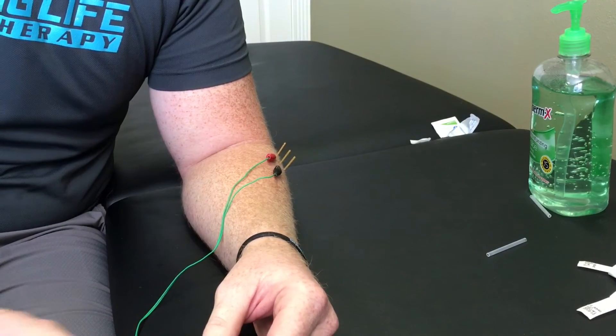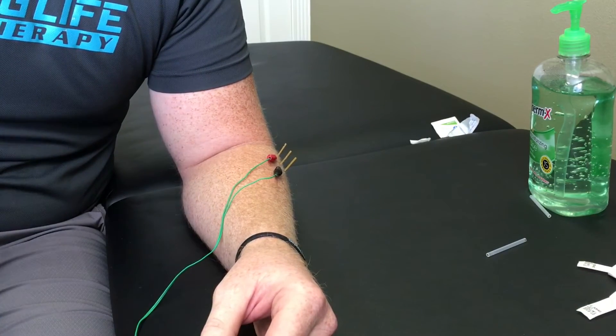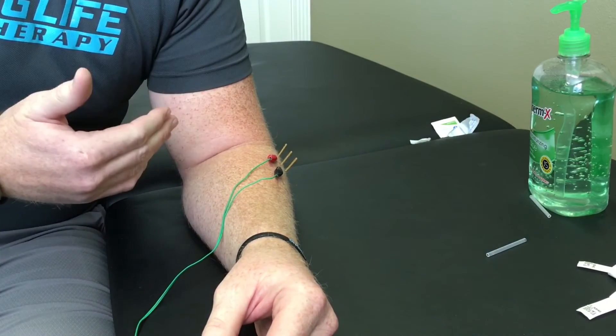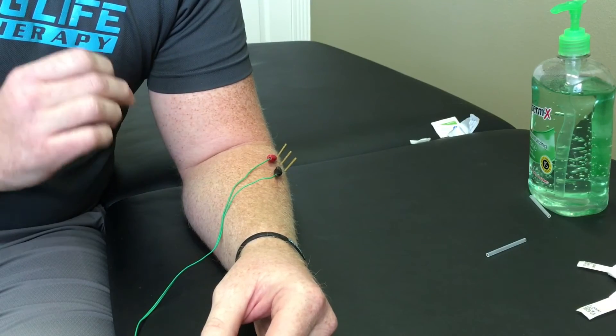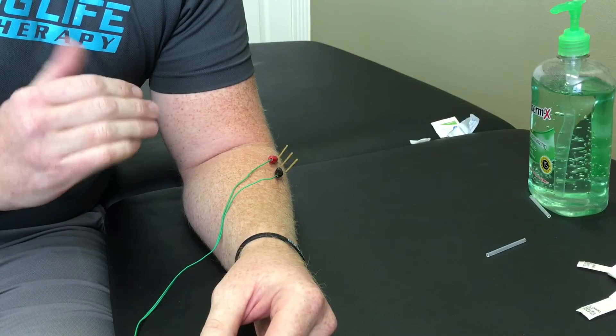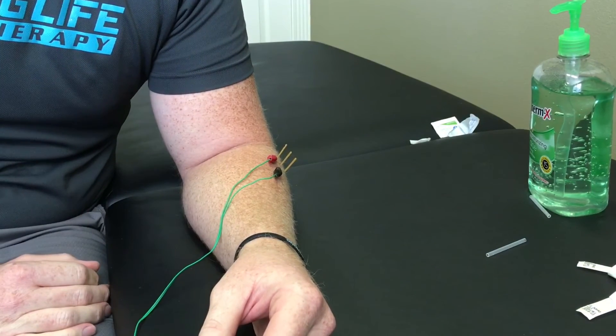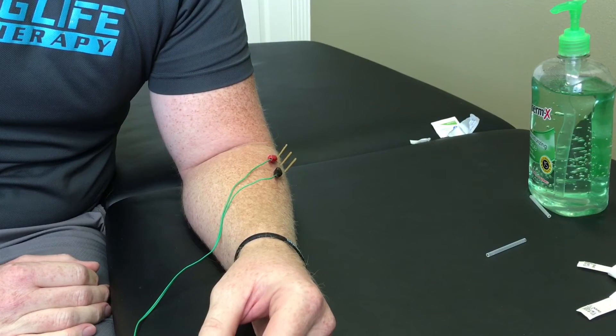The electrical stimulation helps the effectiveness of the needling. The needles conduct electricity and deliver it right down to the trigger point in the muscle where it's needed, instead of having to travel from the surface down to the muscle like with an electrode. It causes some twitching — it's definitely an interesting sensation, but it's not painful.